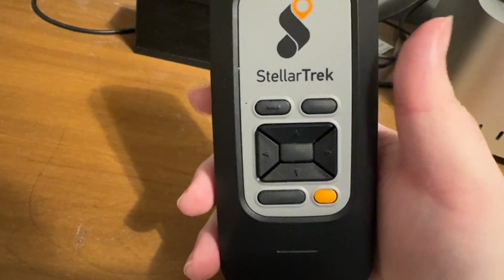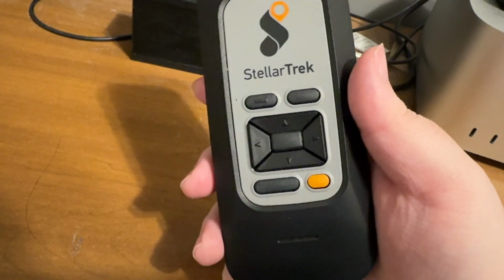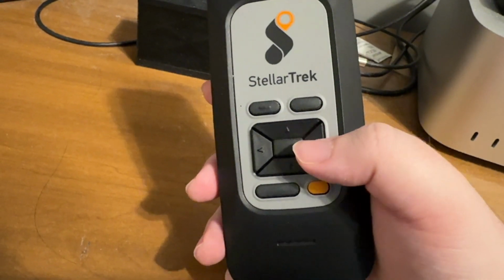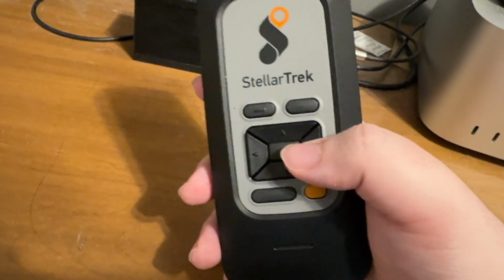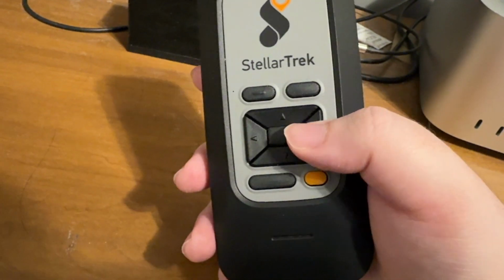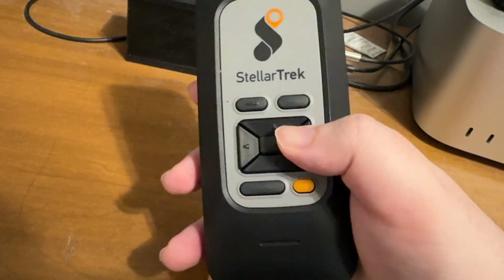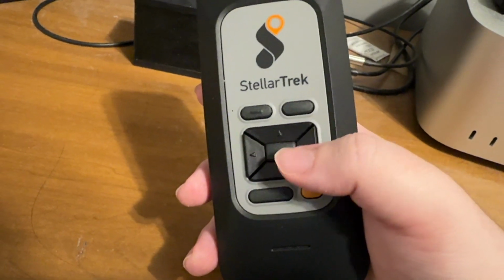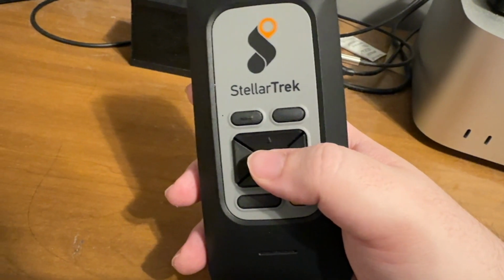Settings. Pedometer disabled. Press confirm to enable pedometer. Okay, and the first option is pedometer. We want to go to system, so I'm going to press the right arrow. Bluetooth. Wi-Fi. Personal data, voices, maps management, key describer, system. Okay, there is system, so let's press the confirm key in the middle.